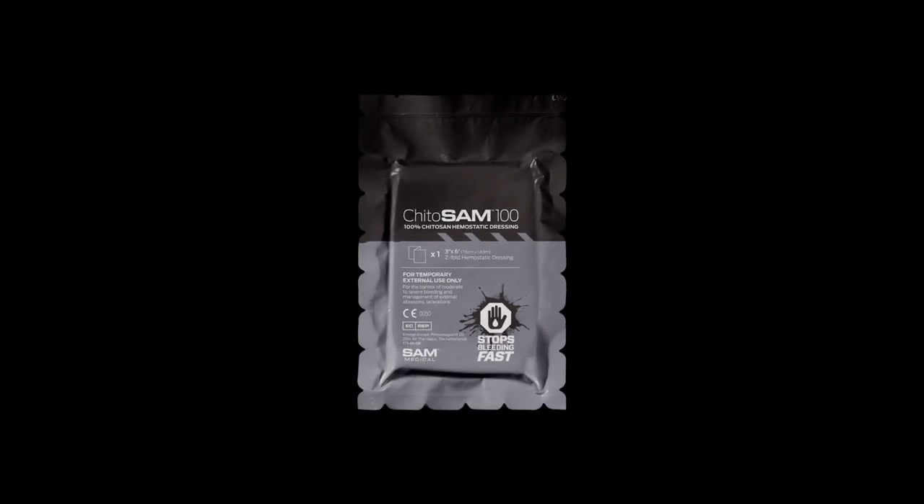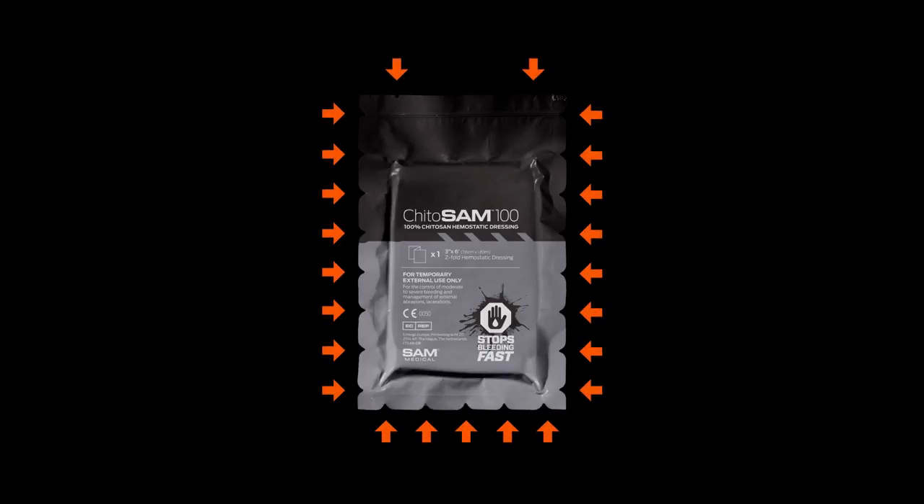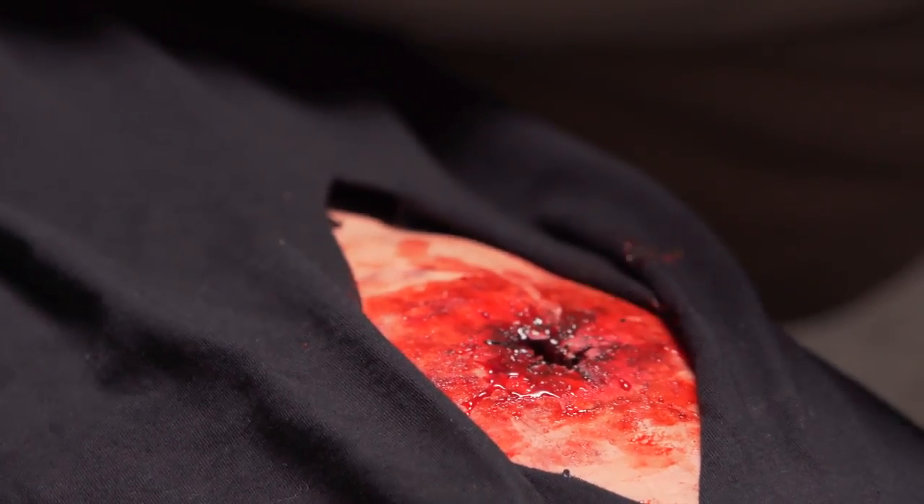Select the appropriate dressing size. Kaidosam's Tear Anywhere Package Design allows it to be quickly opened at any location. Quickly open the Kaidosam 100 and remove the dressing.